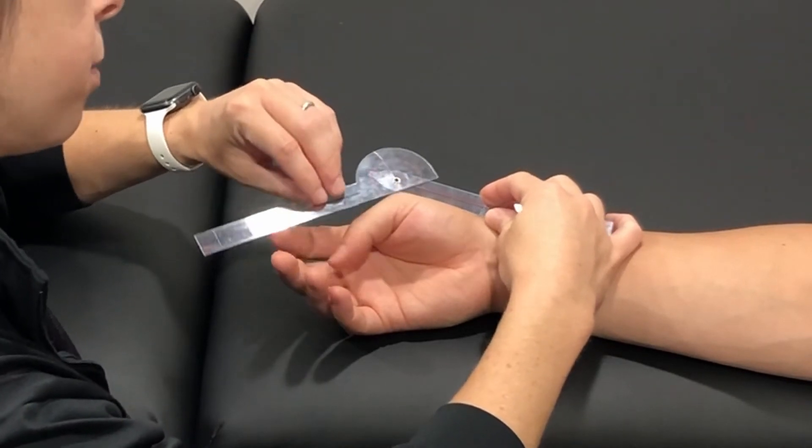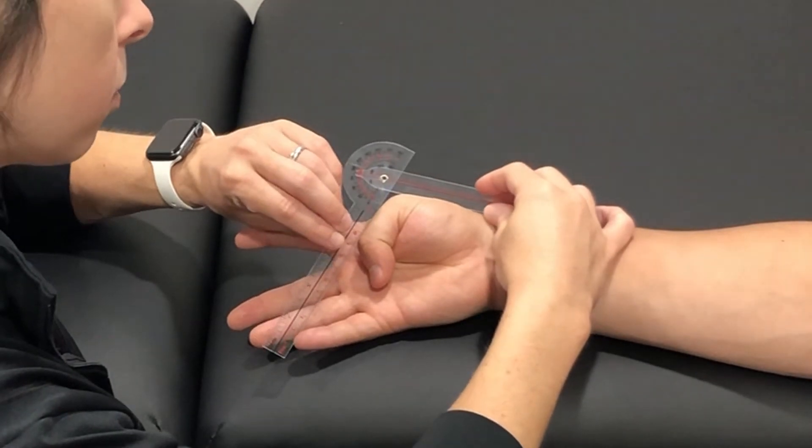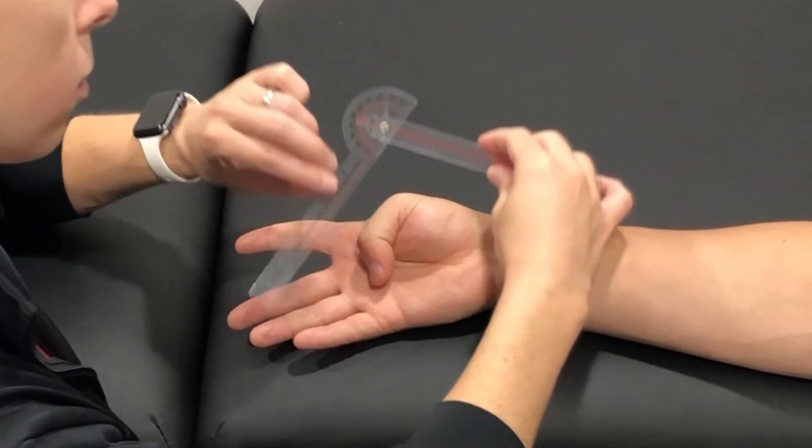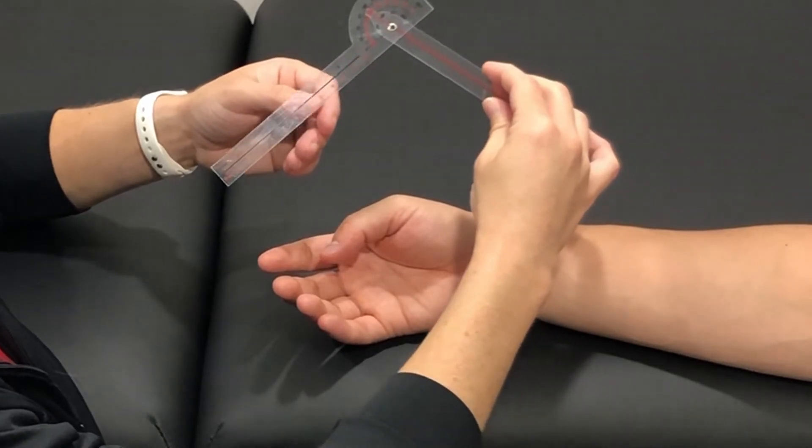Go ahead, pull the thumb down. And that is flexion of the metacarpophalangeal joint of the thumb.